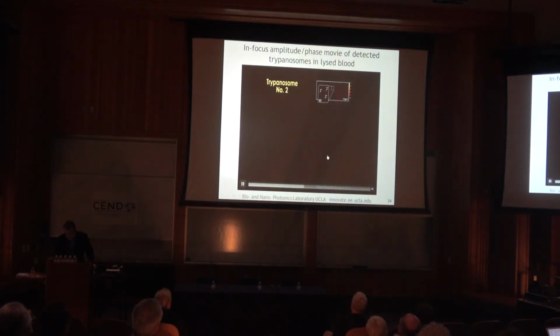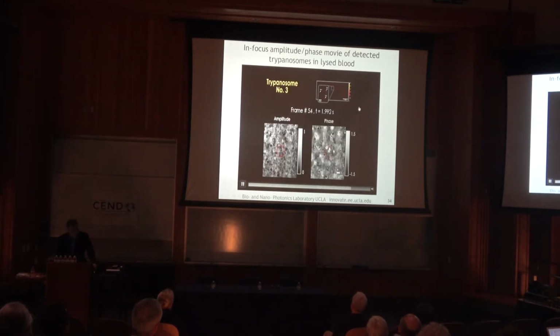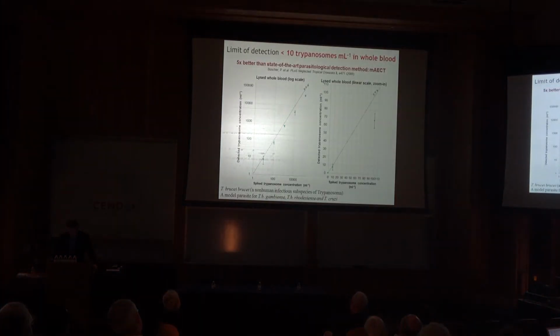The phase signature, if you carefully look at the phase signatures, you can actually see the wiggling of the live parasite there. That's essentially the signature that's boosted up after differential analysis to these bright spots over there. So this is happening across all those 3 tubes in parallel to screen about 3.2 milliliters in a computation time of a few minutes with a laptop.